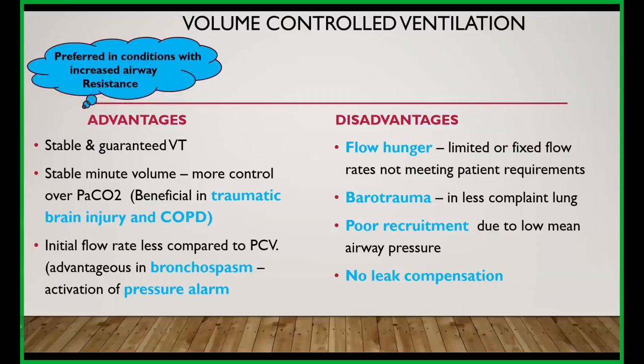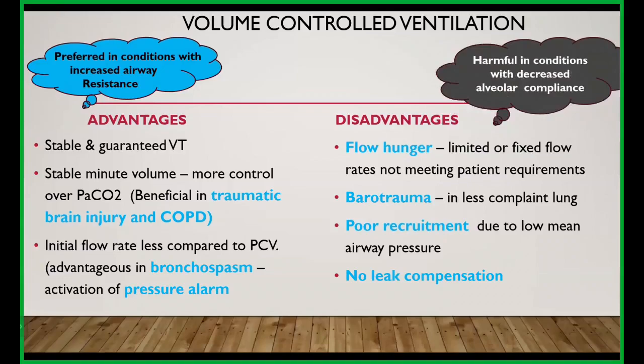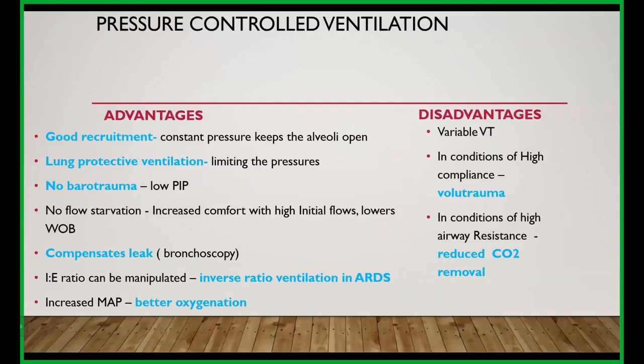So volume control ventilation is good for patients with increased airway resistance, whereas it's very harmful in patients with decreased alveolar compliance. Now coming to the pressure control ventilation advantages and disadvantages.